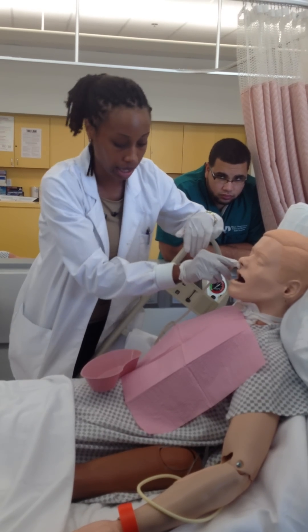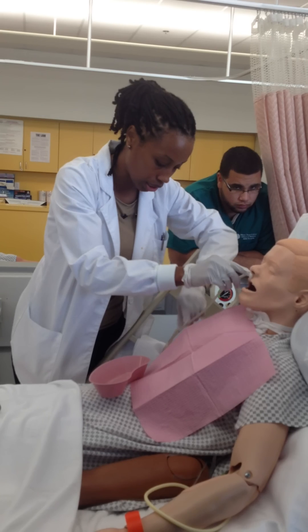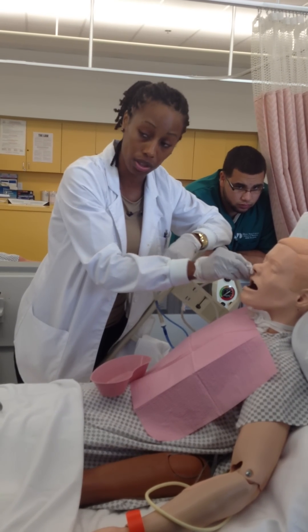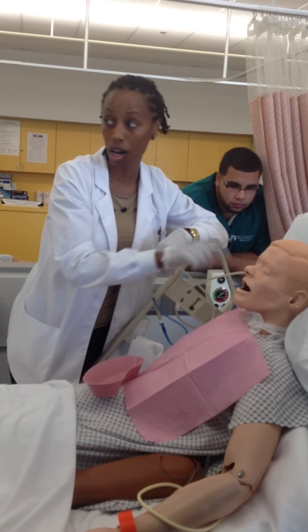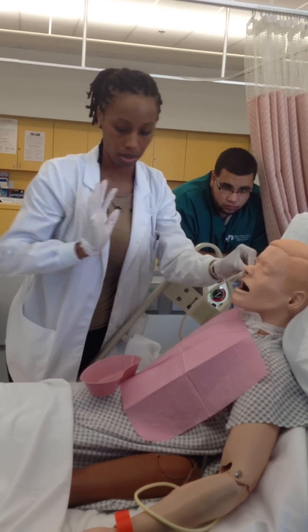When you make it past that point, tell them to lean their head forward and take sips of water, and you're going in as quickly as they will allow you until you reach your tape mark. The mannequin won't let you go in far, but on a real patient you continue to go. Take sips of water and go — when you get the tube up to your mark, you've made it.